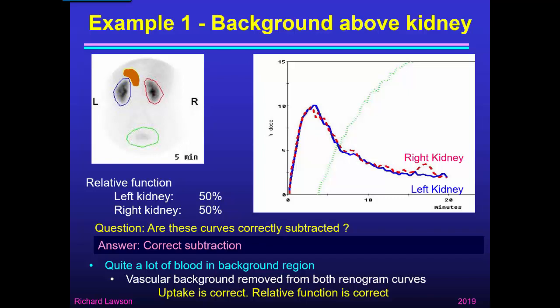In this case we had a background region with quite a lot of blood in it. Above the kidney there are vascular structures like the spleen and the aorta. So we have removed vascular background from both renogram curves, and this background region has got the right amount of blood to correspond to these kidneys. So the uptake is correct, which means the relative function is correct — 50% to each kidney as we suspected from the beginning.